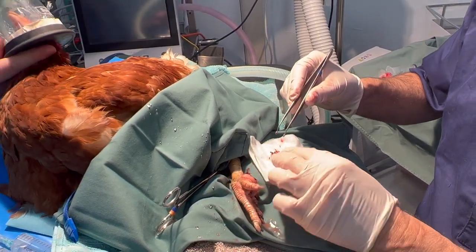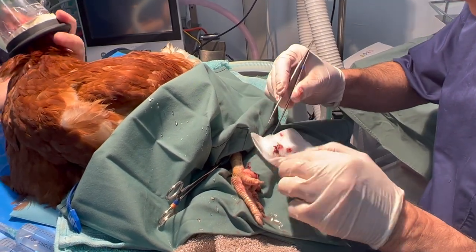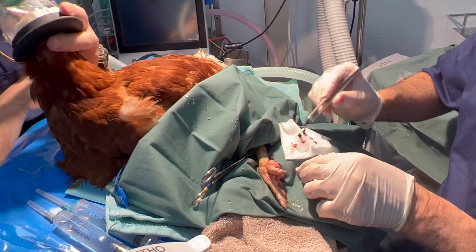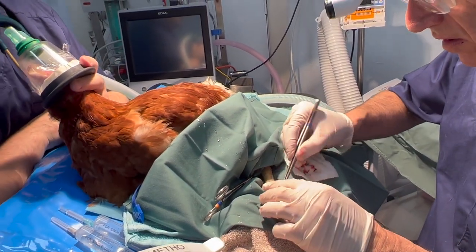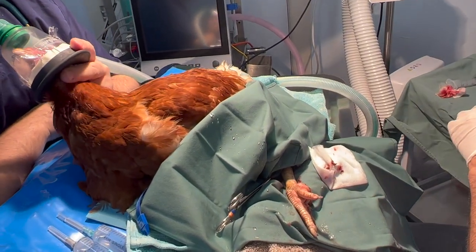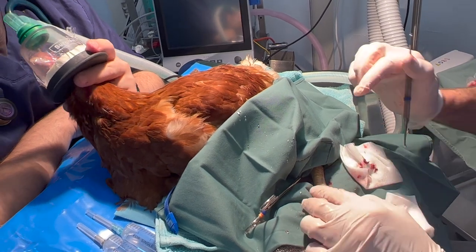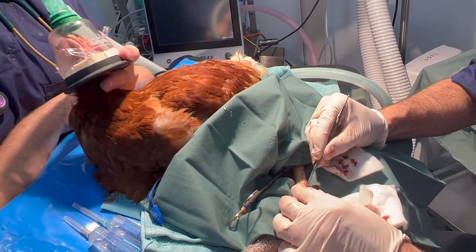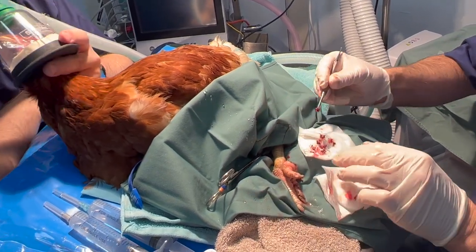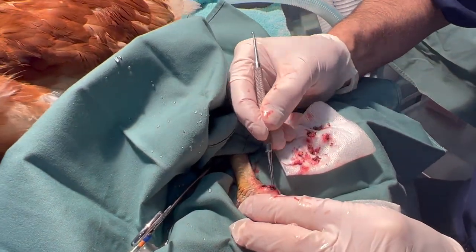I'm going to have one and a quarter ISO because it's a pre-medicated patient and it's an older bird — it's a good anesthetic level. Beautiful color, great respiratory rate. As far as anesthetic goes, you try to keep the bird lighter if possible — maintain a good depth balance between not too light and not too deep. In birds where you can't use much voluntary monitoring equipment, that is quite difficult, but because we're not reacting to any input we're quite comfortable.